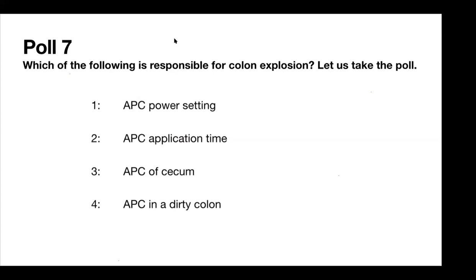I don't know why they did that in 2018 or 19 because they just reported it this year. The patient had a colon explosion, and they reported that the patient actually survived. This happens because of the methane gas in the colon. When you do electrosurgery in a colon that is not prepared with a full colon prep, the methane gas can explode.